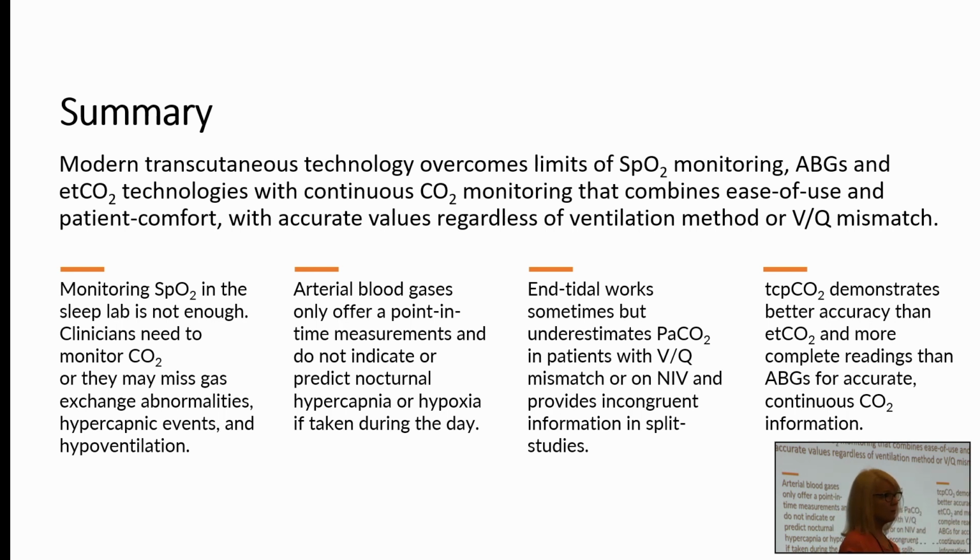Right. That's a great question. And keep in mind that there's a couple of different transcutaneous technologies out there, and with those technologies that use the digital technology, you don't have to change that site every 2 or 4 hours. It can remain in place for 8 to 12 hours. There are no contraindications for diabetic patients.